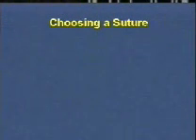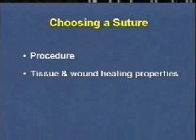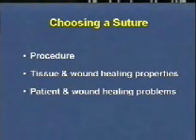The final decision on the choice of the most suitable suture material and needle combination rests on the careful consideration of a number of essential factors. The operation, access and the type of tissue being approximated will determine the needle choice and the size of suture gauge to be selected. The tissues and their wound healing requirements will determine the choice of suture for any particular operative procedure. Other patient-related factors that may result in potential wound healing complications will further influence the choice of suture material.